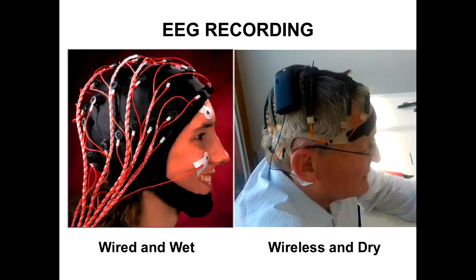For instance, I just went through this: if you have a kid and they're not sure if he's having seizures, you can bring them into the hospital and do 24-hour monitoring, and I can just tell you that is not a pleasant experience for a kid. So if you could actually do it at home in batches of two-hour times while they're watching cartoons and they've got the headset on and you're just wirelessly sending it to the cloud and to the neurologist's office, it could be really fantastic. I also mentioned that this kind of system costs roughly $60,000 to $70,000, and it's largely inaccessible to two-thirds of the world for socioeconomic and other reasons, where this thing, I think, eventually could be manufactured for a couple hundred bucks, which means you could get EEG accessibility to lots of people around the world who currently don't have it.